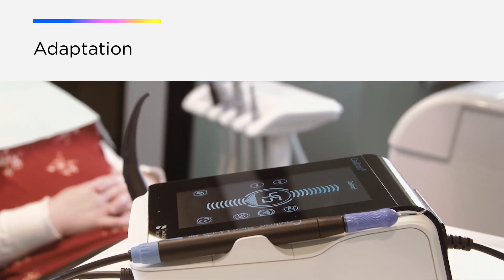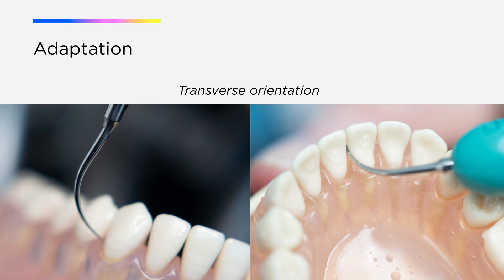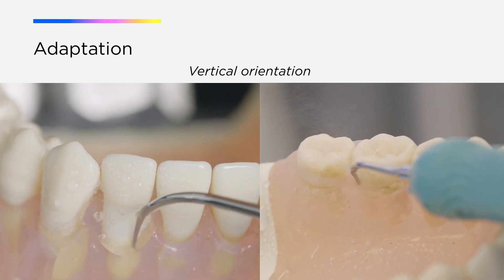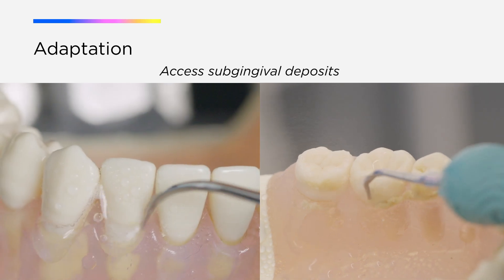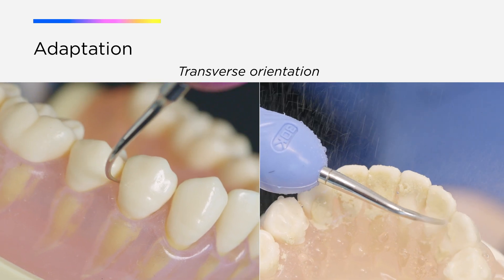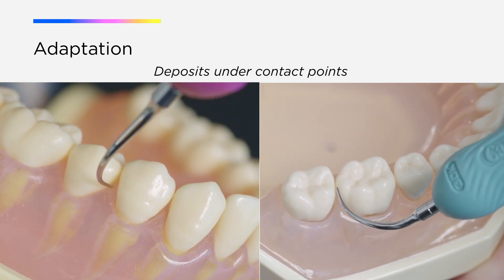There are two ways to position an ultrasonic insert during debridement: vertical orientation or transverse orientation. Vertical orientation positions the active tip towards the base of the pocket like a periodontal probe, and is best suited to access subgingival deposits. Transverse orientation positions the insert more like a sickle scaler, and is best suited for supragingival access and for deposits under the contact points.